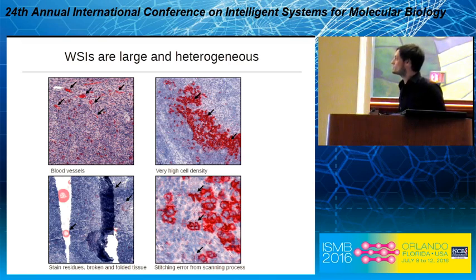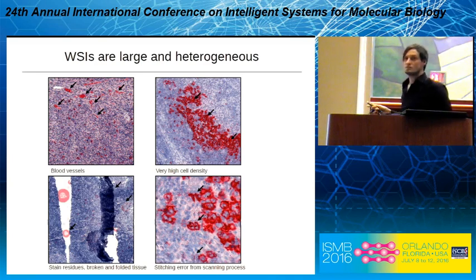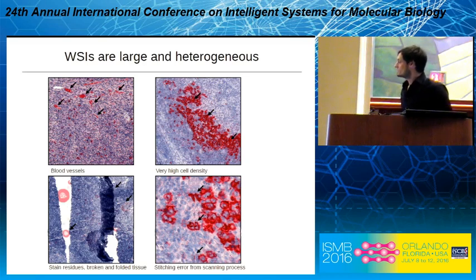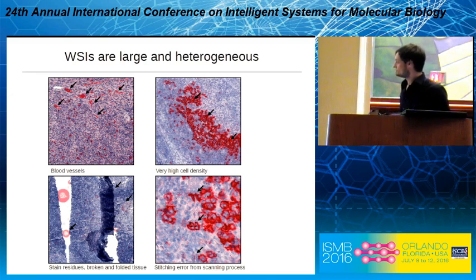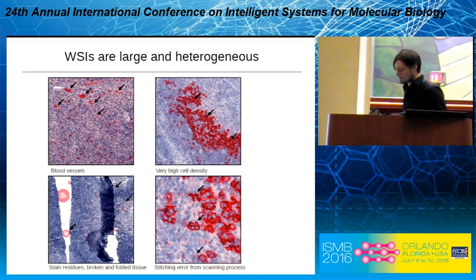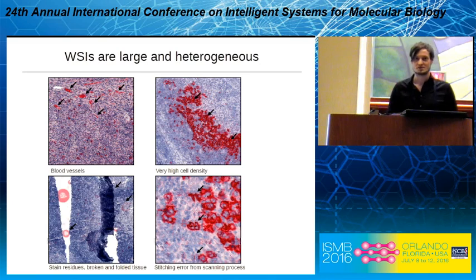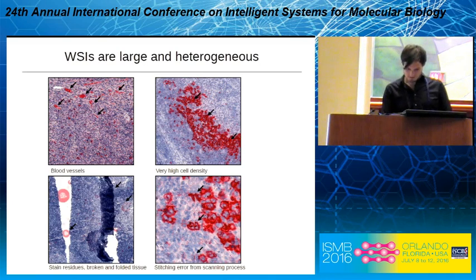Looking at tiles where cell detection didn't work so well — in whole slide images you can always be surprised by what's in there. Some common challenging examples: blood vessels lying between cells; very high cell density, which makes it hard to distinguish individual cells — even for humans it's not possible to determine the size or shape of a single cell; stain residues and broken or folded tissue; and artifacts from the scanning process where cells are duplicated. You can also find lots of other unusual things — for example, pathologists have written comments on the slide.